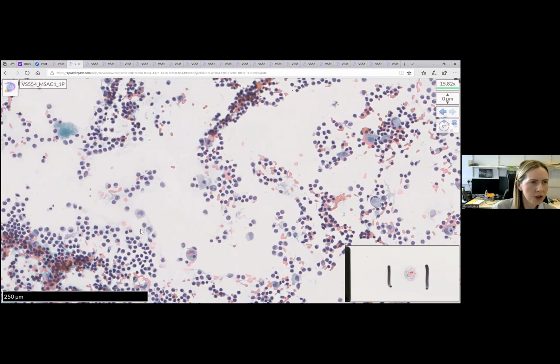Okay, so do you want to use the chat box to make any suggestions? Is there any history that you've given? Sorry, I might have missed out on the history. Yeah, the history was a 76-year-old male with a unilateral effusion. Oh, right. Yes, thank you. Okay. Unilateral effusion, 76 male. What are your thoughts?